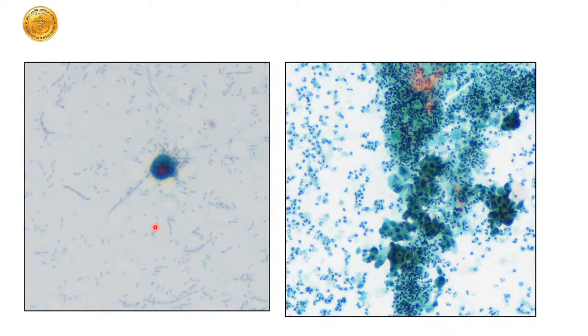Right. Another picture to show you, this is the same slide with the degenerated urothelial cell, a beautiful Melamed-Wolinska body. Another urine specimen with a lot of neutrophils in the background. We are not doing liquid-based cytology. These slides are prior to the point where we have now gone back and are trying to classify our urothelial carcinoma slides on the basis of the Paris classification, but this is prior to that.